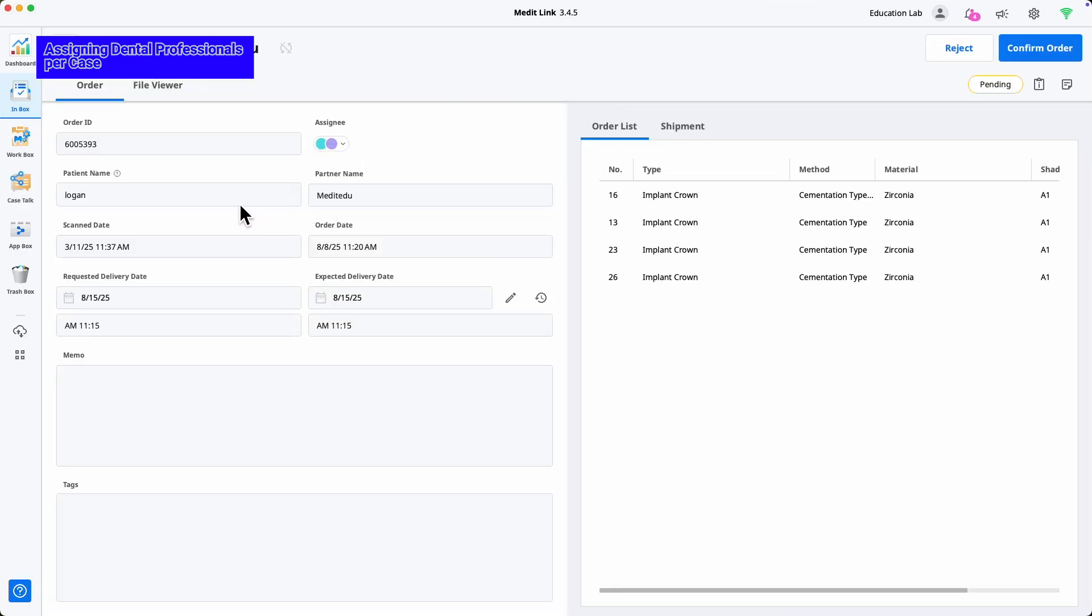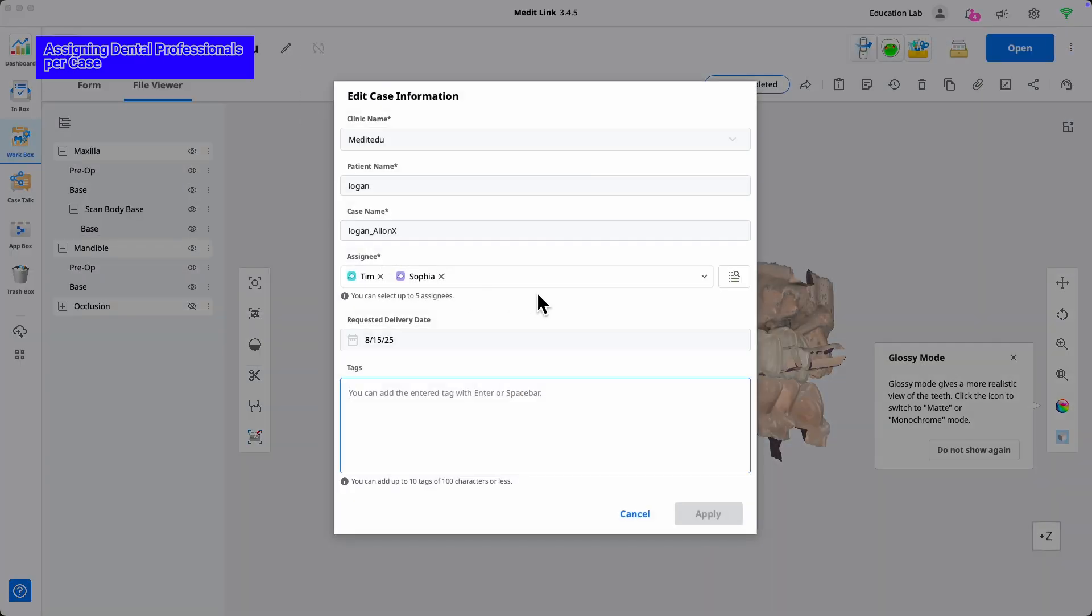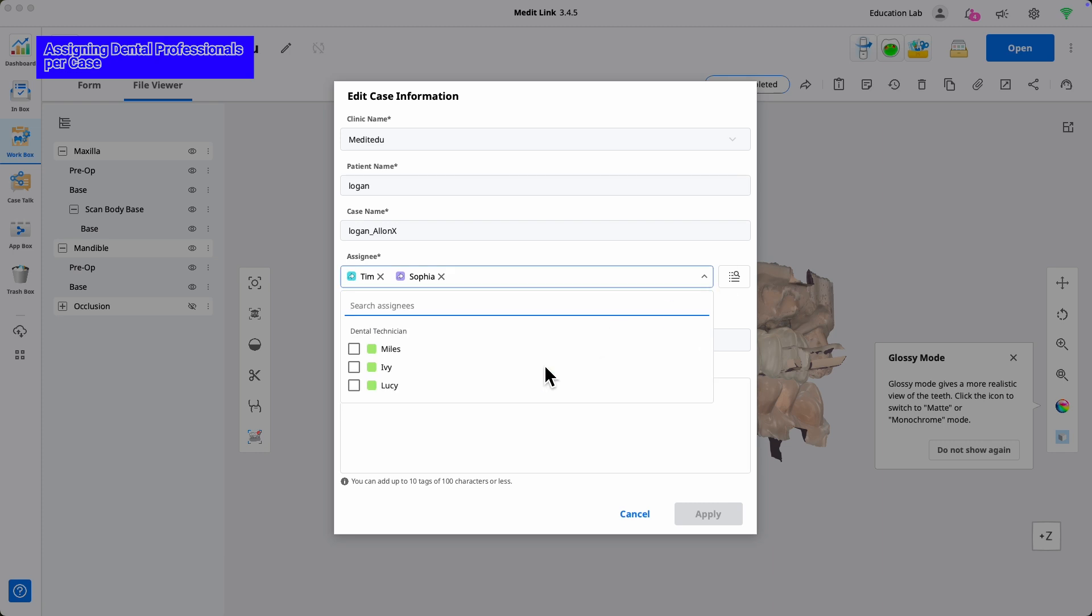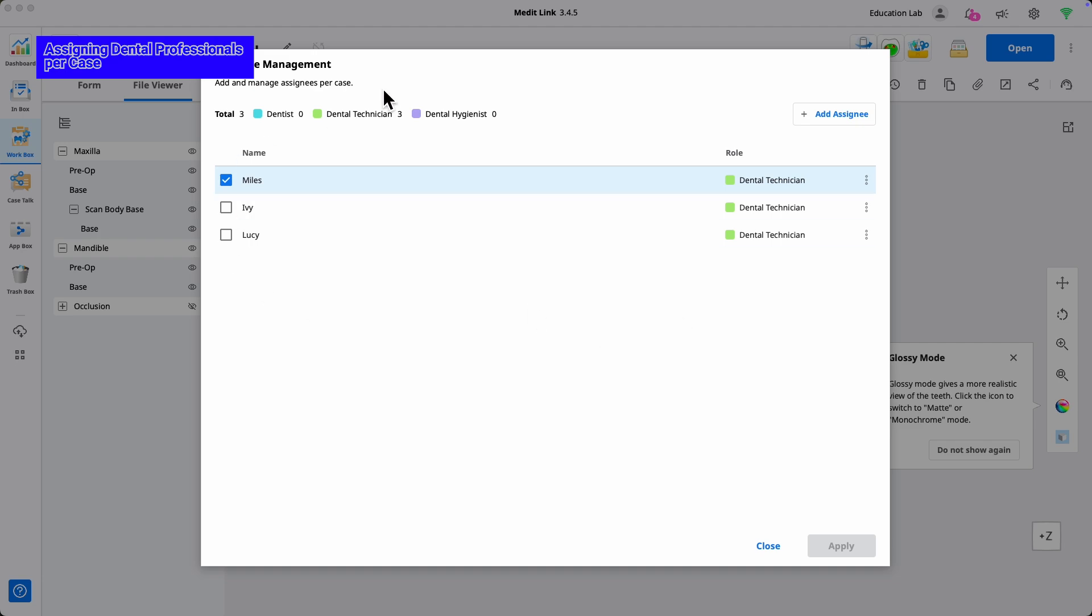With a lab account, you can now see the clinic's assignee for an incoming case and assign your own lab assignee. Now, both the clinic and the lab assignees are connected to the same case.